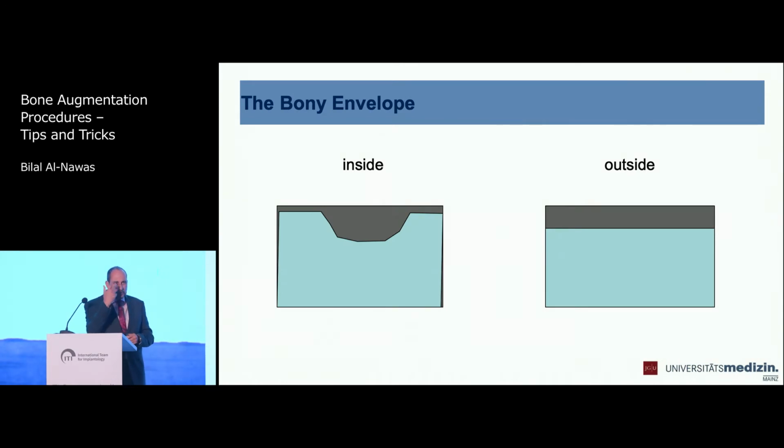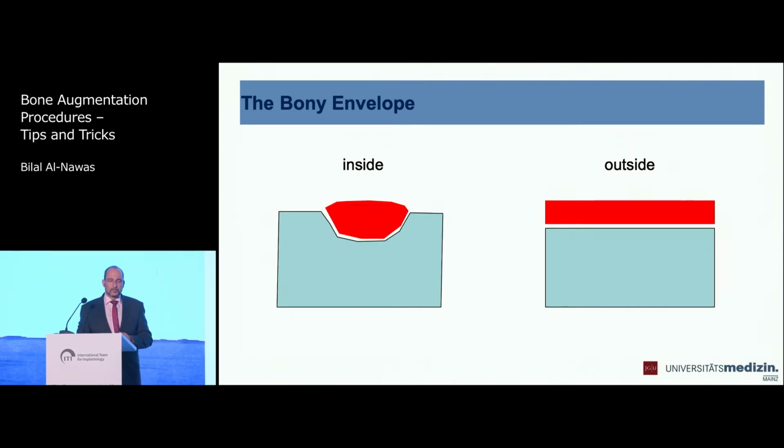So the first thing which should come into your mind when you talk of bone reconstruction is, what type of defect is it? Is it intrabony or extrabony? That sounds simple for you. Of course, it's easier to regenerate the intrabony defect and much more difficult the extrabony non-contained defect. But I see a lot of cases where people use bone substitutes and some membranes in really difficult defects, and then they wonder why this is not working.